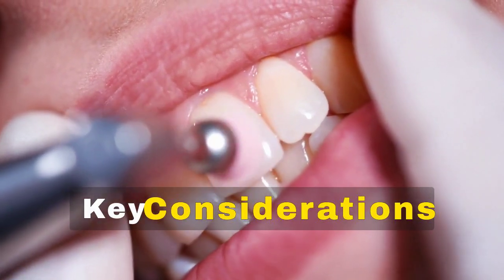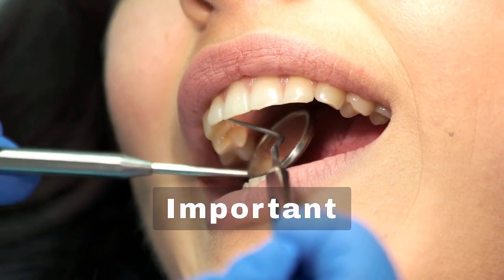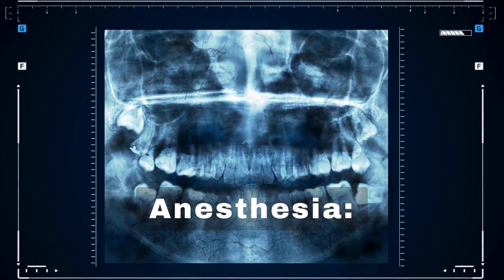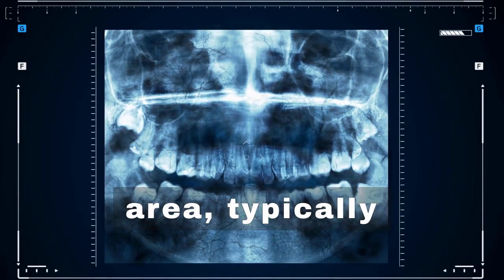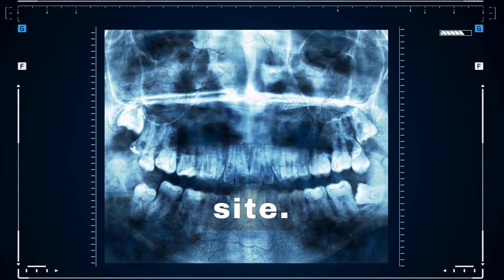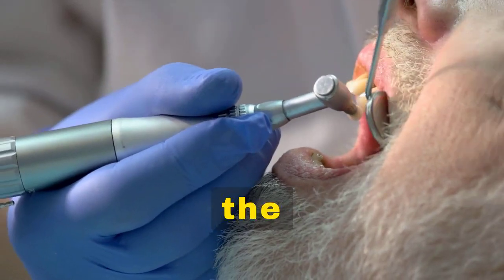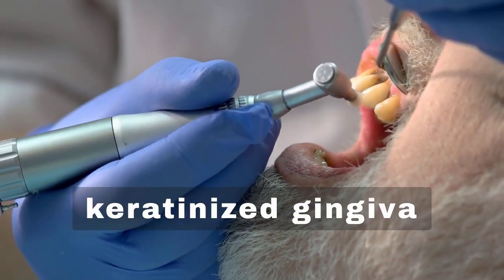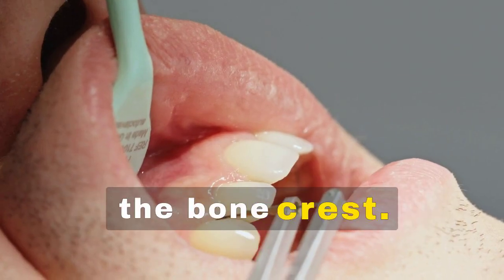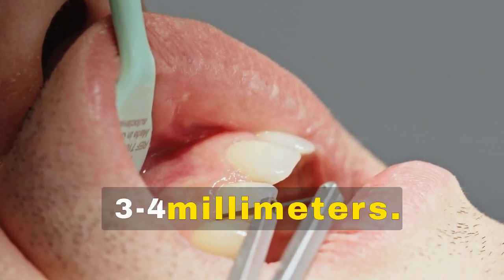Key considerations in crown lengthening. Important factors. Anesthesia, ensuring numbness in the area, typically covering 2 teeth on either side of the surgical site. Gingival measurement, evaluating the keratinized gingiva and using bone sounding to measure the distance to the bone crest. Ideally, this distance is 3 to 4 millimeters.